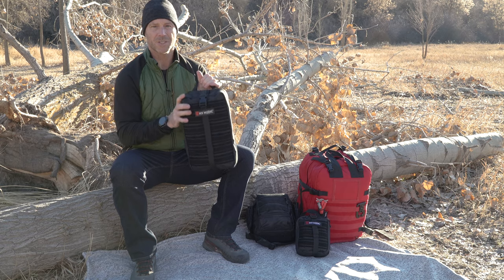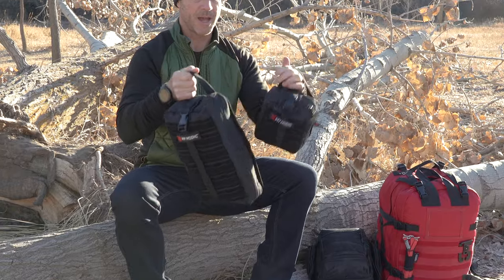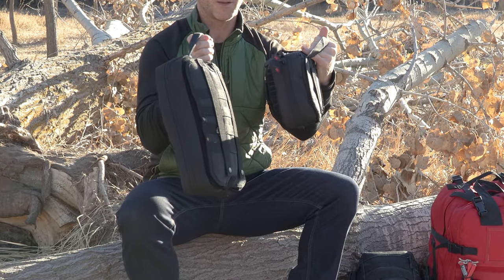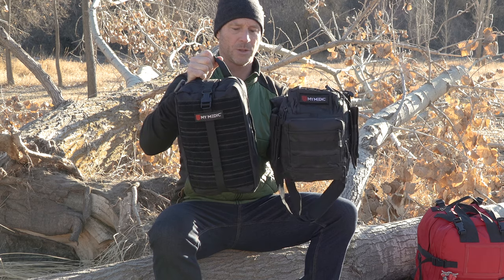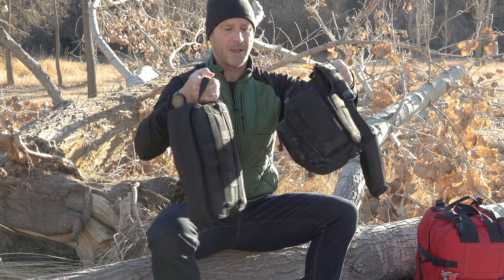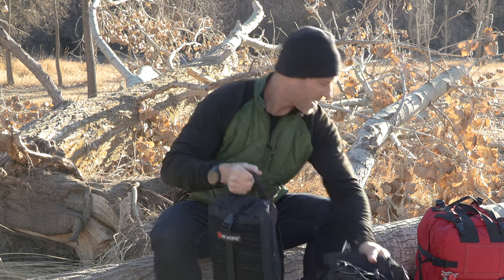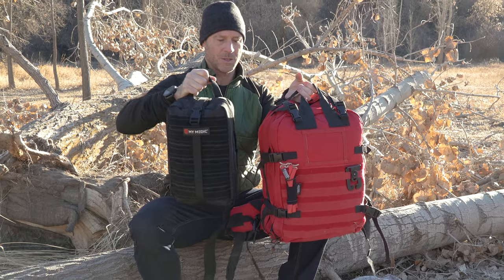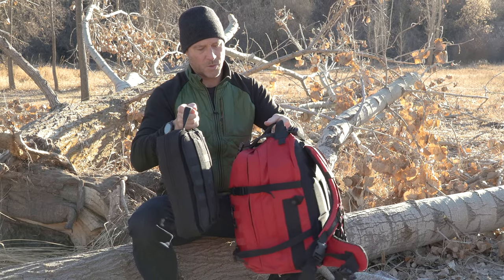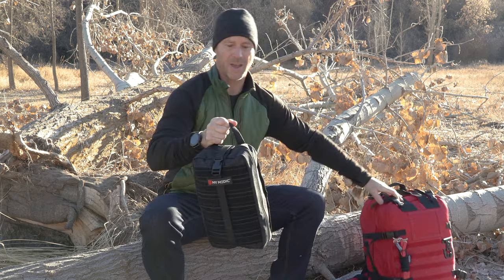Real quick, I want to give you a size reference — the MyFak Original. The MyFak Large is about twice the size of that. You can see it side by side, and then of course the front view. Our Recon bag is a little chunkier, while this guy is a little slimmer on the side profile. And then finally, the big daddy, the Medic — so you can see it's quite a bit smaller than the Medic, but still a great, great kit.